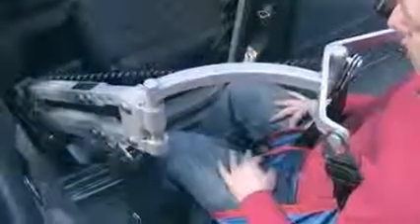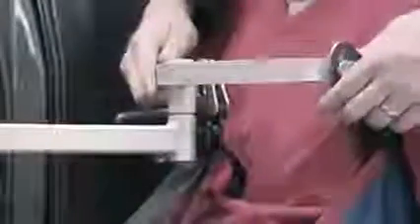The wheelchair is then placed underneath them and the person is lowered down into it. The sling is then disconnected.